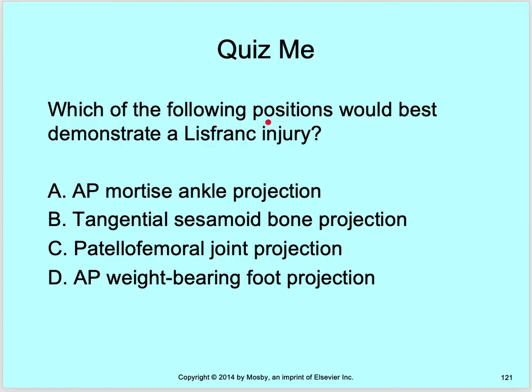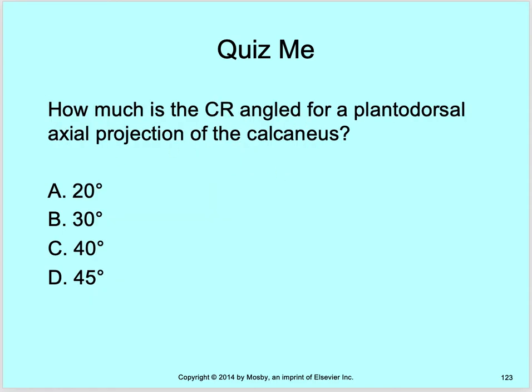So which of the following positions would best demonstrate a Lisfranc injury? And I remember talking about a Lisfranc injury. So we need to know which position we would put the patient in and what we would be imaging for the Lisfranc. And if you go back through your notes, or if you remember, it is going to be the AP weight-bearing foot projection for the Lisfranc injury.